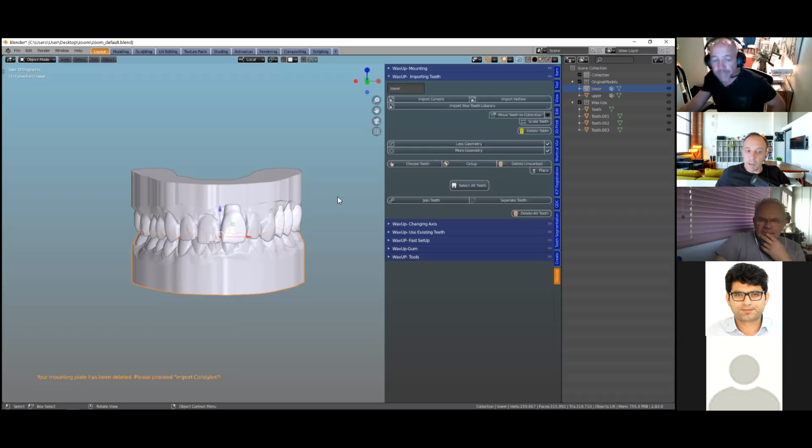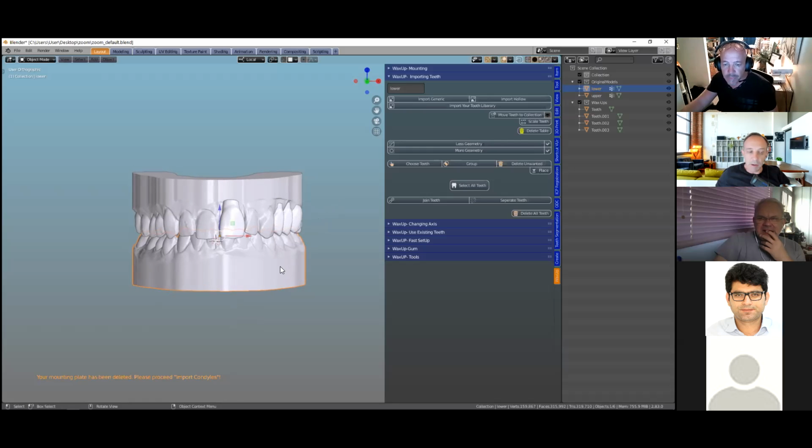No, I don't have questions. And I do see the logic of the mounting table so that you can get that snap-on effect to where you want it.